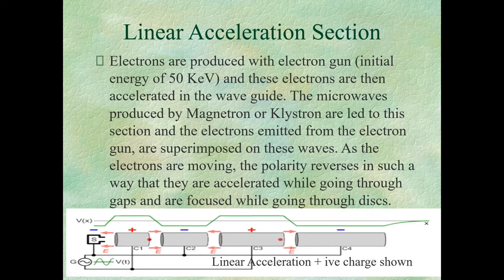We imagine, actually, we are not applying any voltage across any tube when we are talking about linear accelerators, but we just imagine that if we had applied a voltage of 6 MV across the X-ray tube, we would get this X-ray energy. So that's customary, that's just denoting it with this, and it's not actually applying the voltage across the tube.